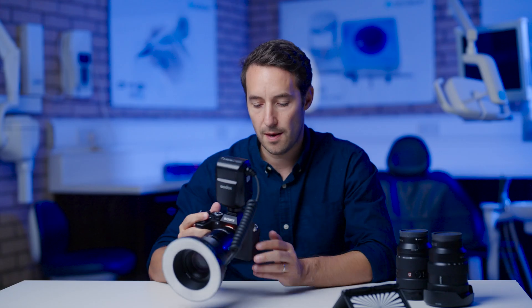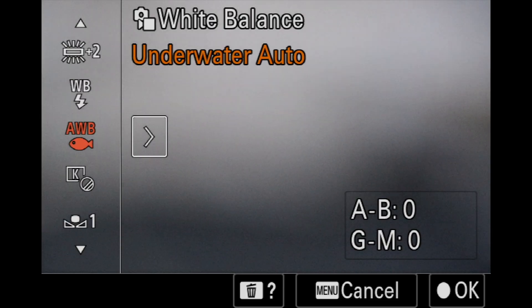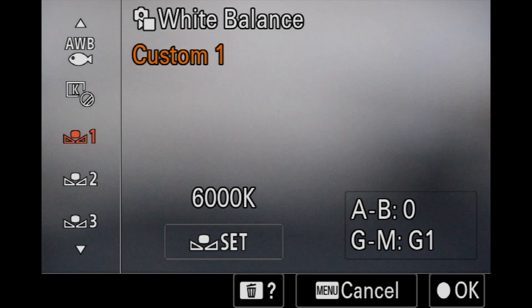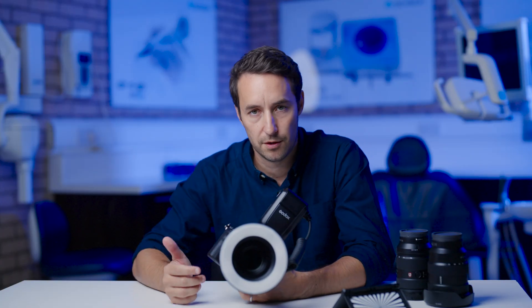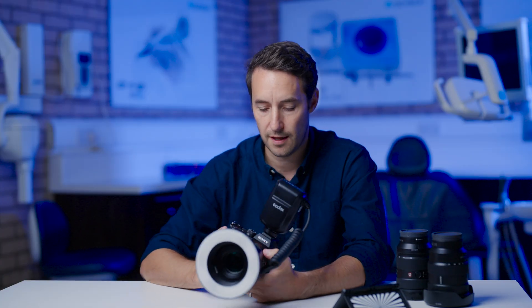This is now saved to custom one, so I would set my white balance to custom one. Each time I go to custom one, it will always be set at 6,000 Kelvins and it will retain that setting every time I'm shooting.